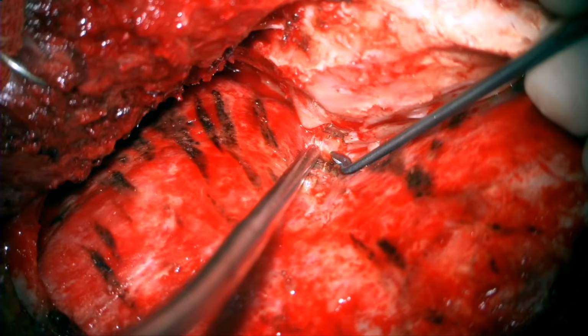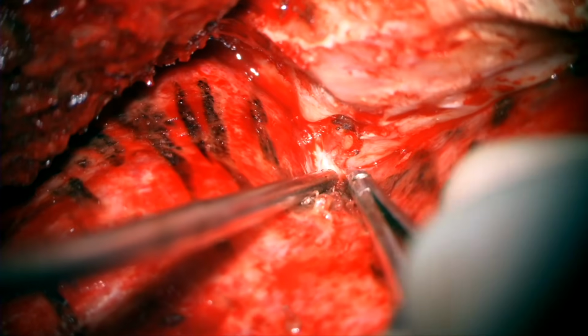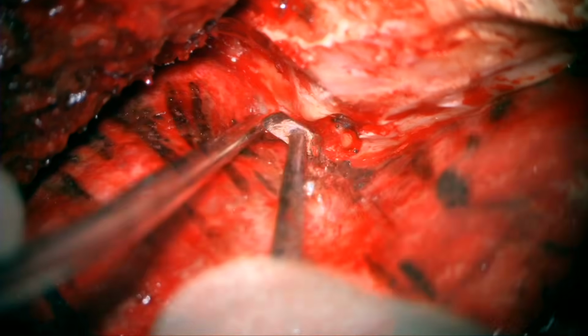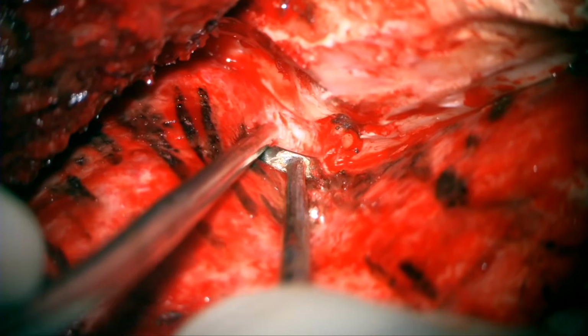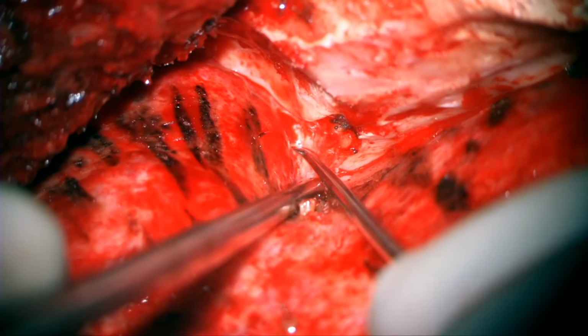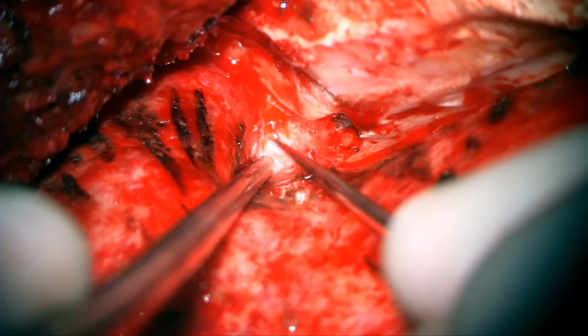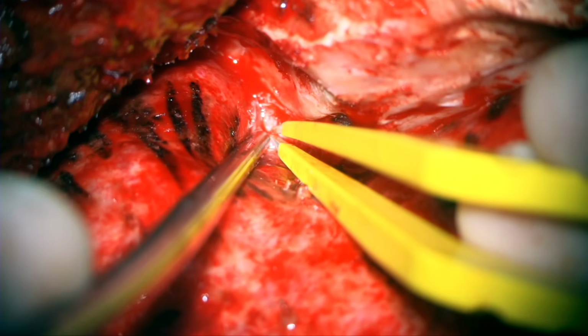This dural fold after transection gives us access to the superior orbital fissure, anterior clinoid process, and lateral wall of the cavernous sinus, all in an extradural fashion. We keep peeling this dura gently until we start exposing the lateral wall of the cavernous sinus.